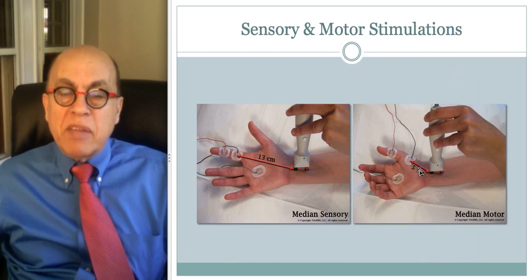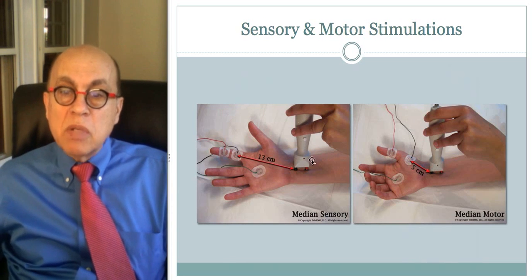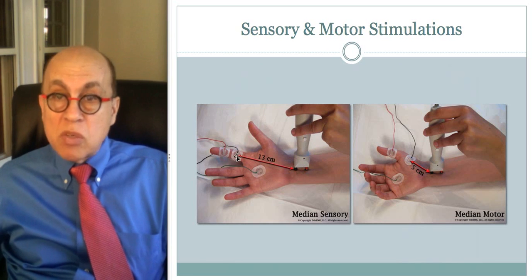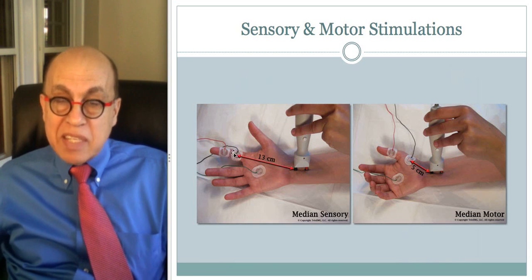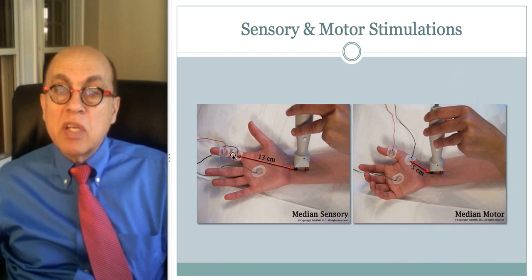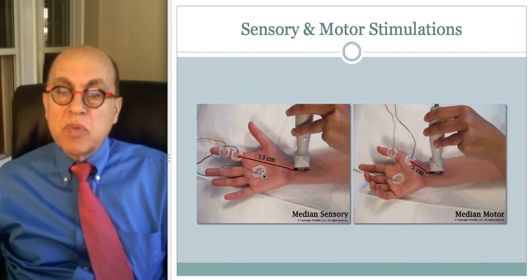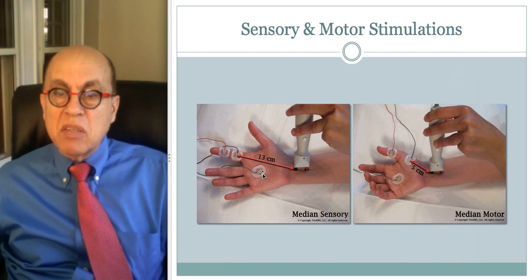What do I mean by that? Here's a stimulator. I'm positioning it over a nerve, and I'm recording from the finger. There are no muscles in the finger. So basically, in this case, I'm recording from nerve. You can see the 3 electrodes that I spoke to you about. The green is the ground. It's put somewhere on the hand in a relatively silent area.